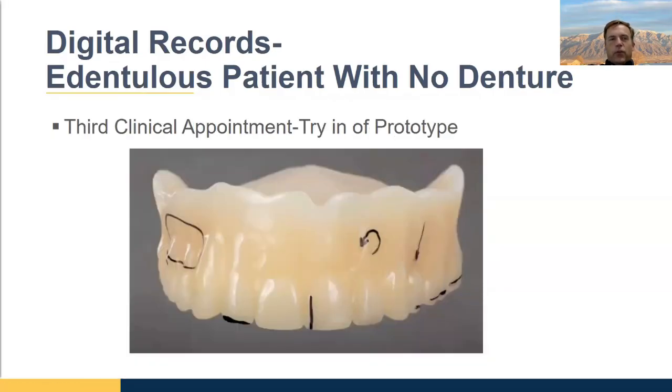Again, this is your third appointment, and I have the same picture because it'll be the same thing. Make sure that everything is good, because the final will be this plus any changes. I would really recommend the test drive thing. I think that's one of the coolest things about the digital process, is that you have something sturdy enough for the person to wear. Now, I get that it adds another appointment, but if you bring them in quickly and tell them ahead of time, I'm going to be sending home a one color denture for you to try, so that way you can see what it's like in your actual life and let me know.